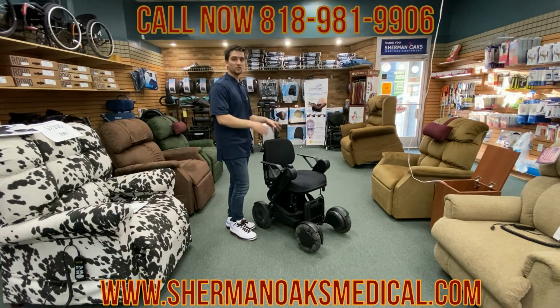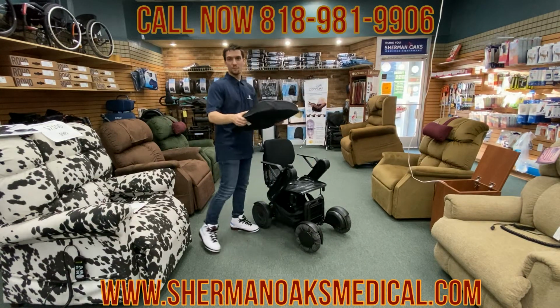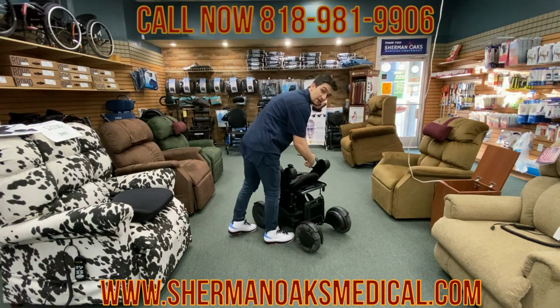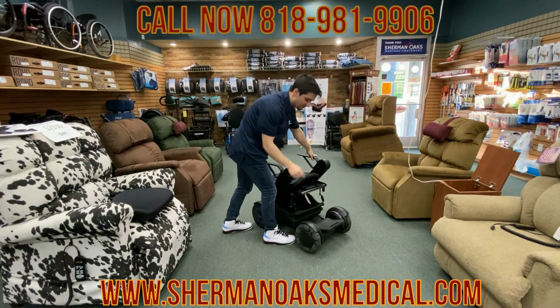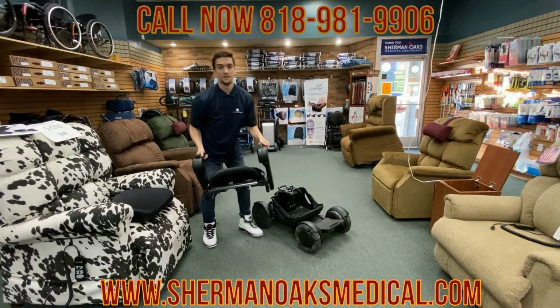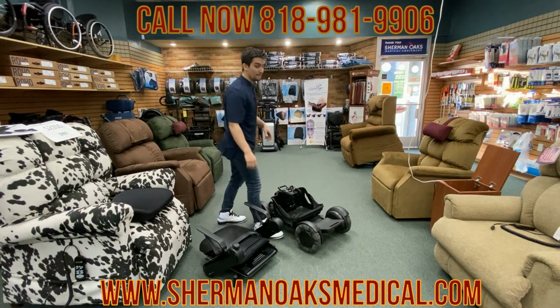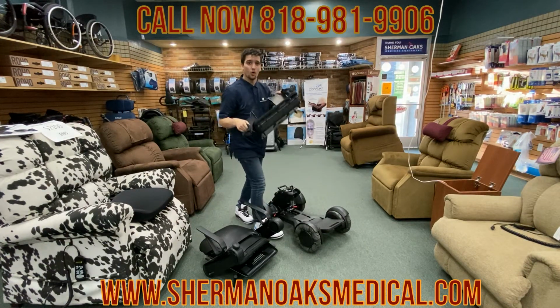So we're going to go ahead and start with the first piece, which is our top section. Our cushion is removable and comes right off. We fold our back down, and there's a lever underneath the seat that I'm going to go ahead and pull up. Once I pull that lever up, I can then remove the basket, the 2 straps that hold it, and lift my seat up and off. So that's my first piece. That's going to be about 32 pounds right there. My basket then is Velcroed on, comes right off, and has no weight to it.